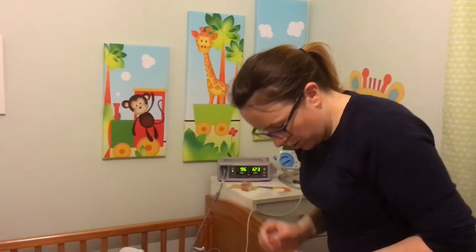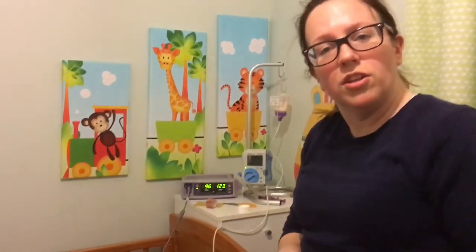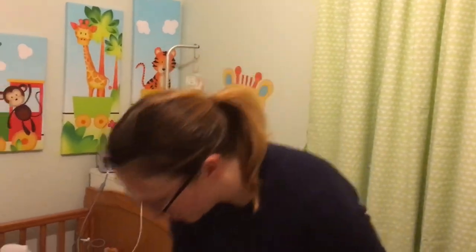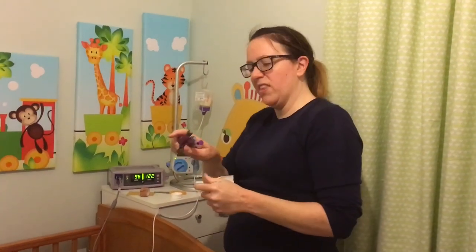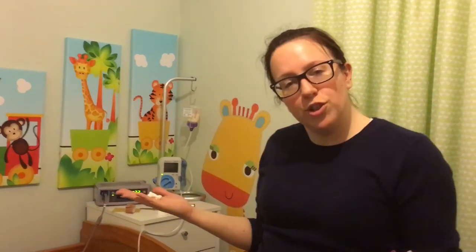So I'm going to throw everything in the bin and then it's pretty much easing down tonight. We're going to turn off the lights, put on his baby monitor and let him sleep. That's Ethan done. And then we have to go downstairs, wash all of his syringes for the day, all of his bottles, and put them in the steriliser so they're all ready to be used again tomorrow. These last for about a week before the numbers generally start coming off, so we have to throw them away and rotate them every week.